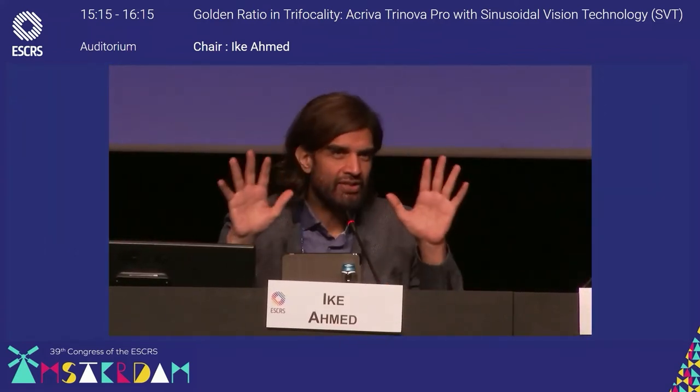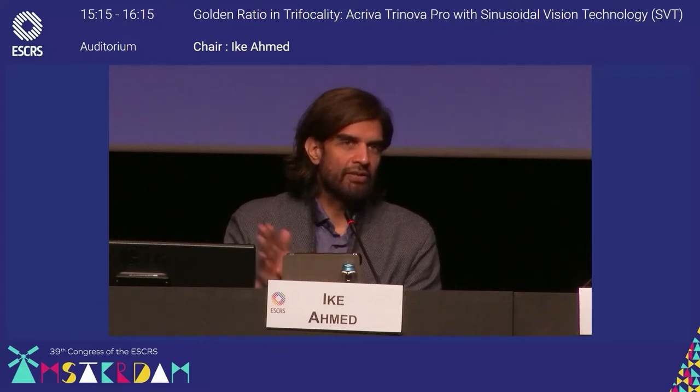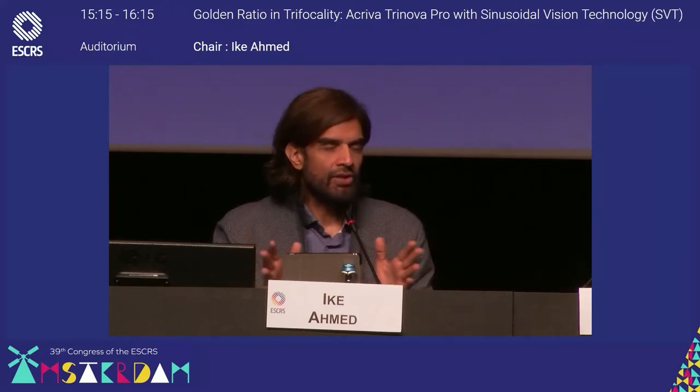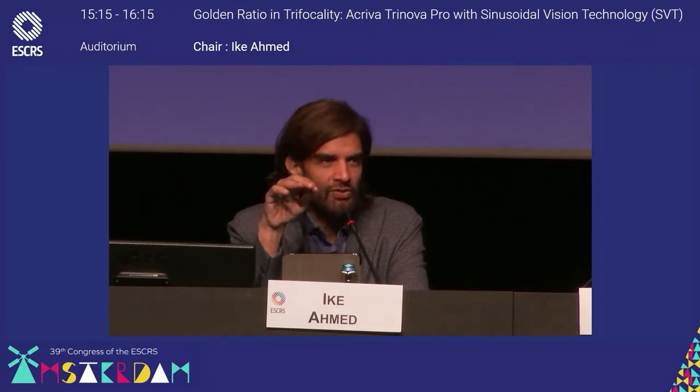We don't like when patients come back and say, I can't see as well, it's waxy vision, ghosting. I think that does help, and the basic optical work really supports that. Because of the lack of these higher order wavefronts that end up causing dysphotopsias, the wavefronts are used all for intermediate, far, and near, rather than having lost light, which causes glare and halos. I hate to be too mathematical and optical, but we are physicians, we're scientists, we have to understand the optics of what we put in people's eyes.